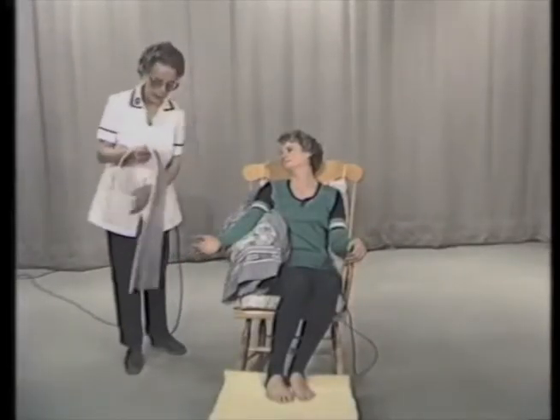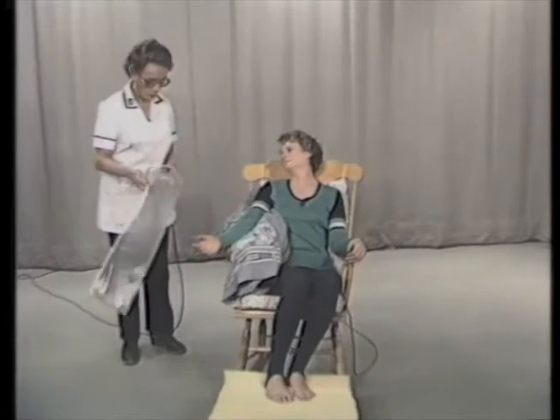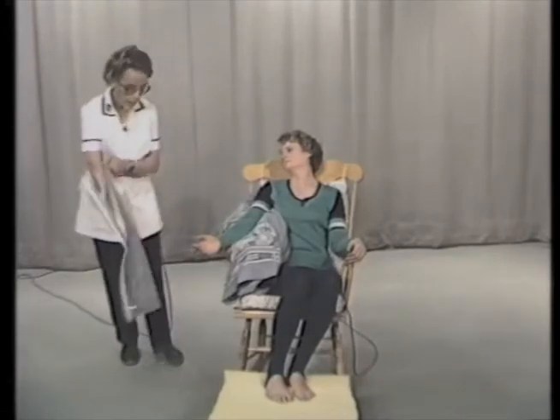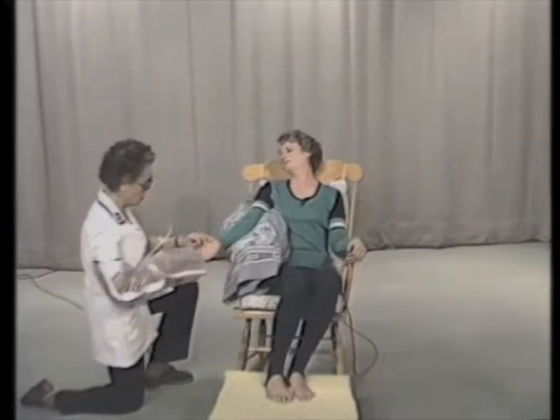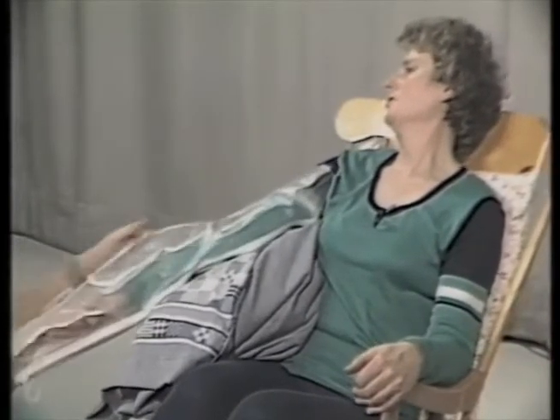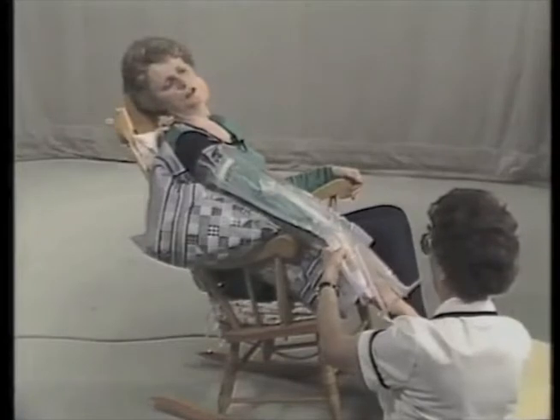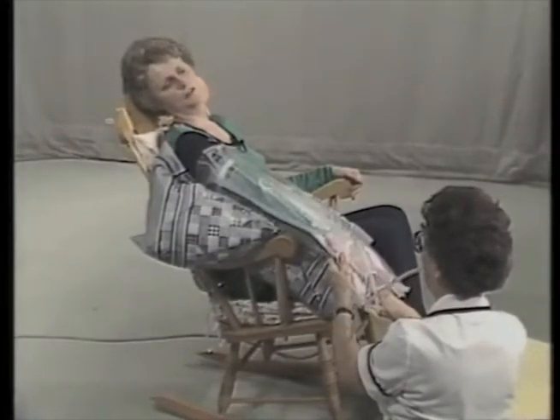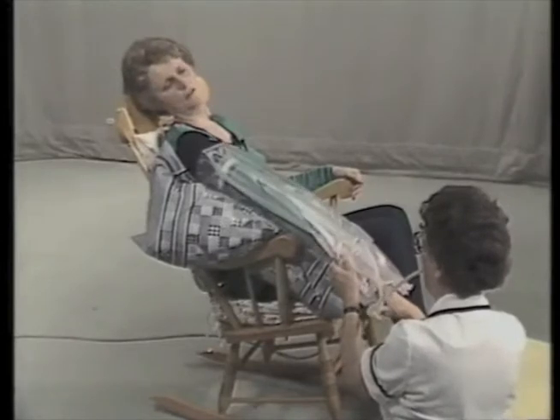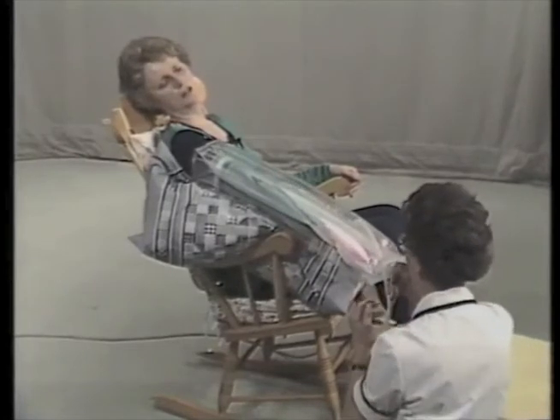Now I'm going to apply it, and there are one or two finer points about the use of this splint which we haven't made earlier and which Anne will now show. It's very important that these splints be inflated by mouth, because the warm, moist air from the therapist's lungs makes the sleeve of the splint move and conform to the patient's limb, ensuring that the pressure is all over and even. The pressure is the same as that of the lung pressure of the therapist, and this will do no tissue damage to your patient.